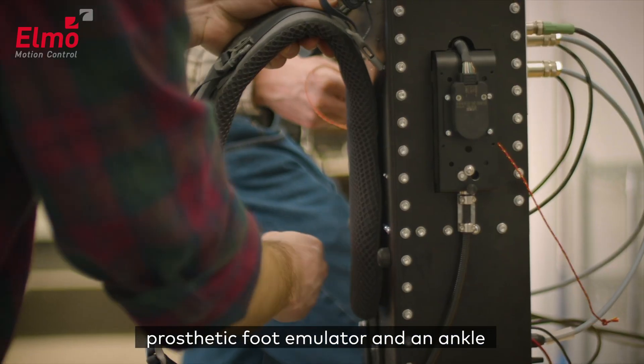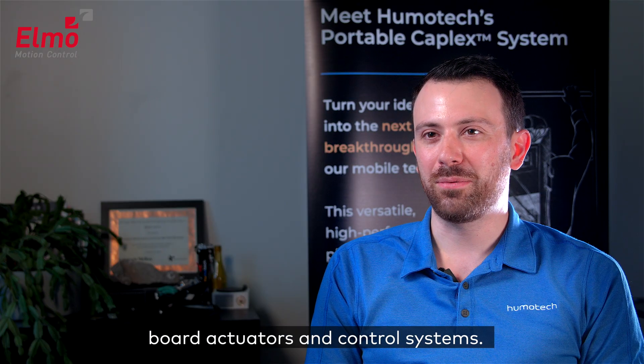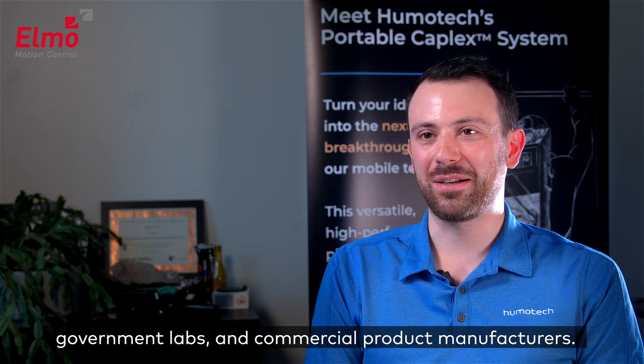Our primary products are a prosthetic foot emulator and an ankle exoskeleton system powered and controlled by off-board actuators and control systems. We support researchers and developers at universities, government labs, and commercial product manufacturers.